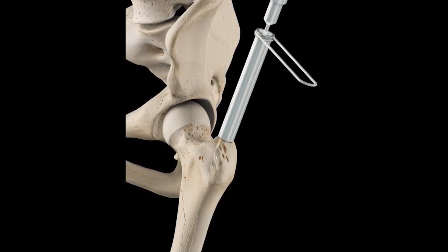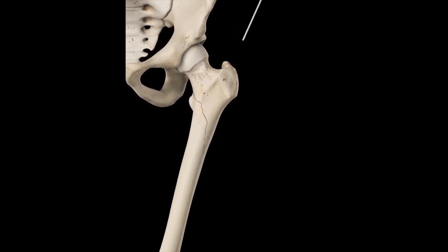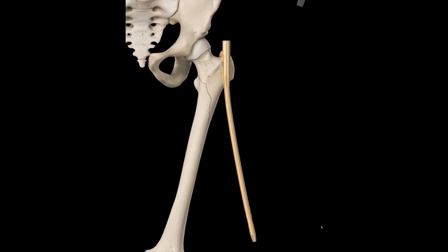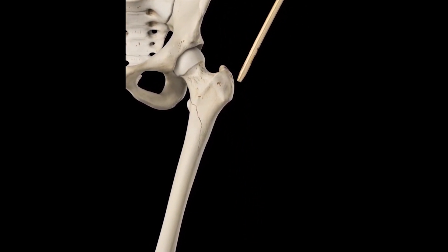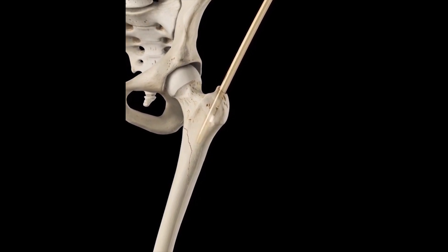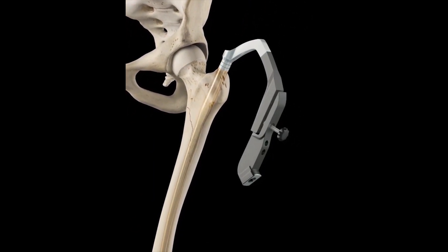pushing through the soft tissue until they rest against the bone. The trocar is withdrawn and a hole for the nail is drilled into the trochanteric area. The short intramedullary nail is then inserted into the bone using an orthopedic insertion device.